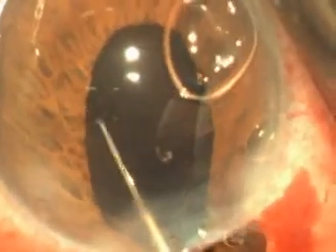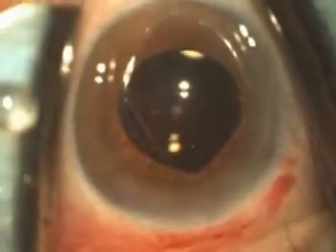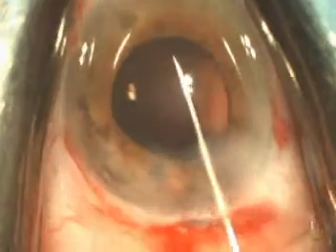The mirror helps the surgeon ascertain the position of an intraocular lens to determine if it is in the desired location. When the pupil is smaller than the capsular rexis, the surgeon may occasionally be unsure of whether or not the intraocular lens is in the desired position. In this situation, the intraocular mirror is useful.